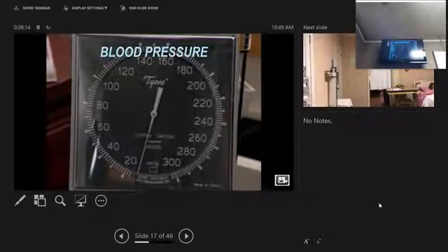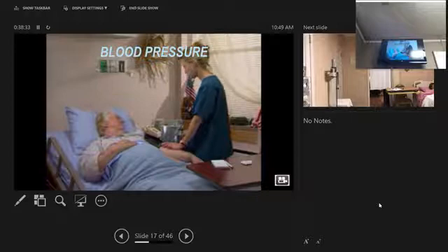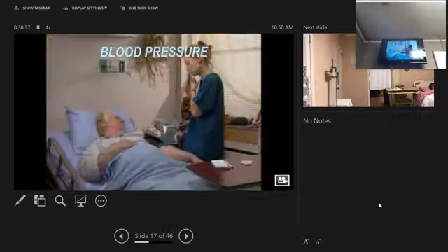Continue deflating the cuff until the beats stop. Note the closest number on the gauge. This is the resident's diastolic pressure. Continue to listen for 10 to 20 millimeters of mercury below the last beat to ensure you have the correct diastolic pressure. Open the thumb screw completely and deflate the cuff.